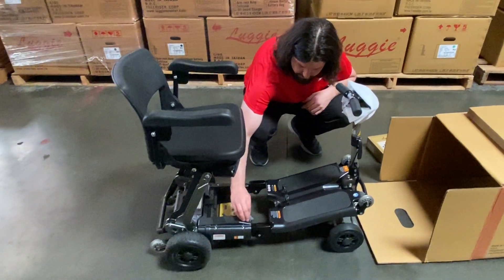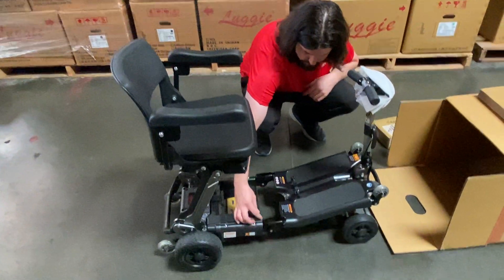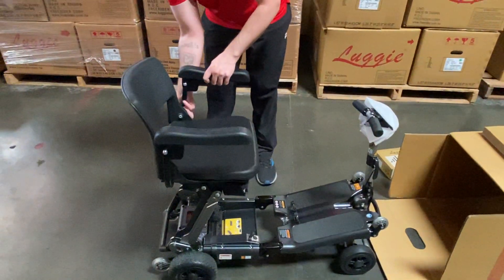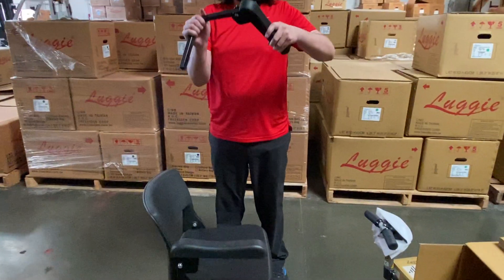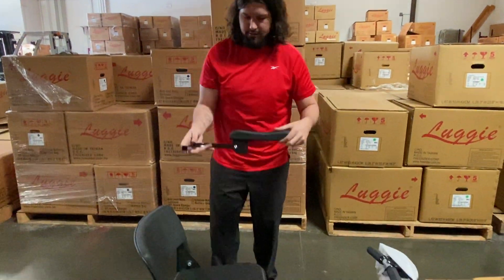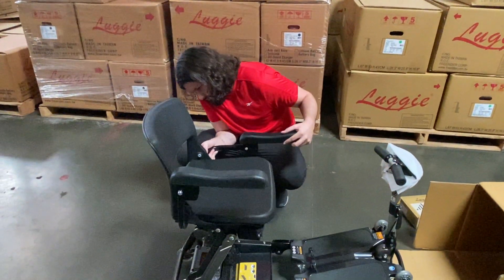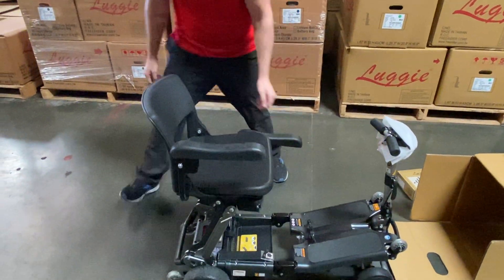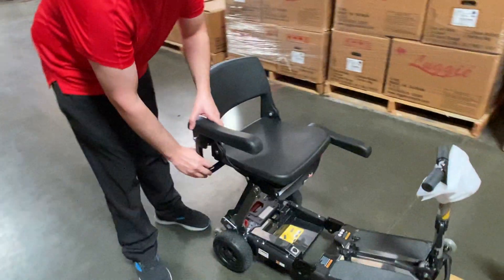Close your charging port. Remember to take your armrests and adjust them back — just flatten them out and stick them in just like this. Do the other side.